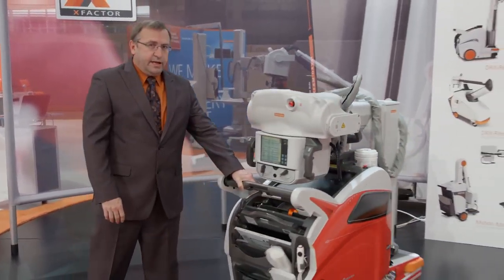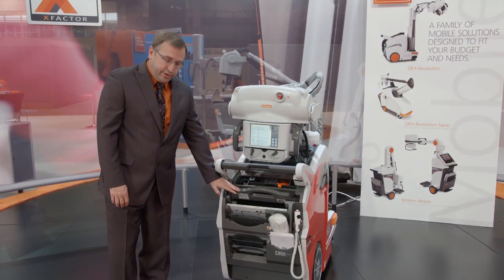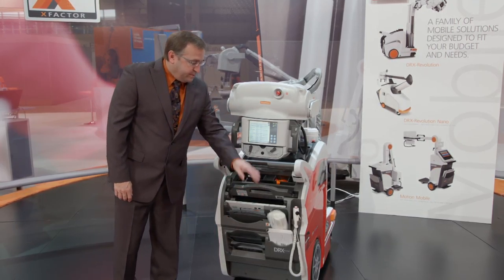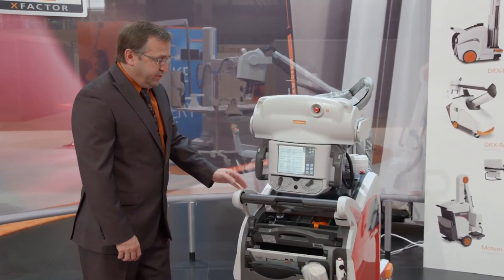And as you can see, it also allows for plenty of storage to handle all your imaging needs. There's plenty of room for your grid, multiple size detectors and batteries that charge on board, including spaces for bags, wipes, pens, pencils, and anything else that you would need to do your daily functions.